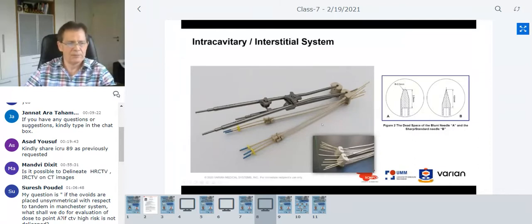So it's easier to insert the needle. And you see that you have needles that are more or less parallel to the intrauterine probe and needles that are angled 20 degrees. By the way, you use these plastic needles, and we have two different models of plastic needles.